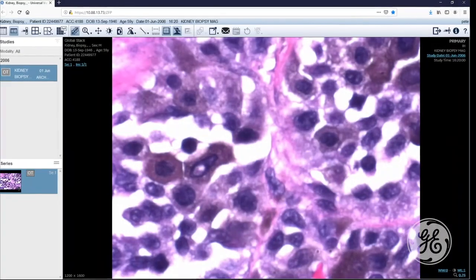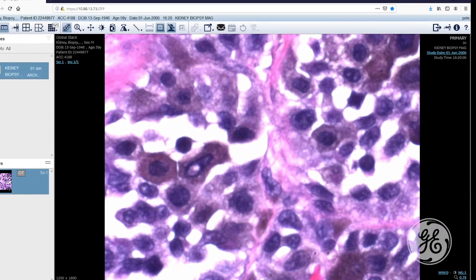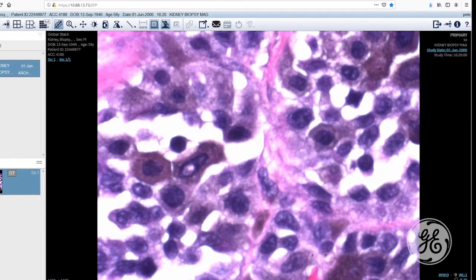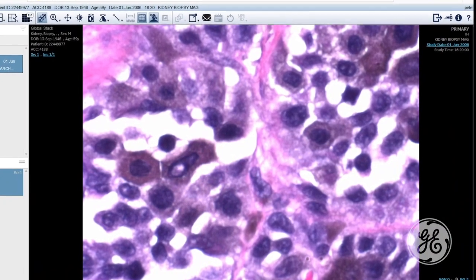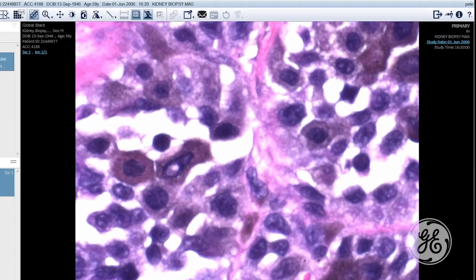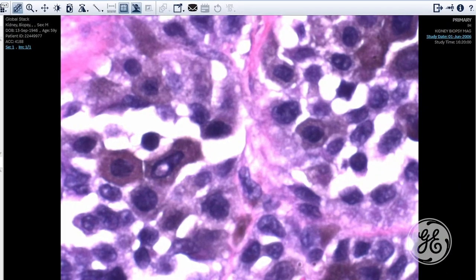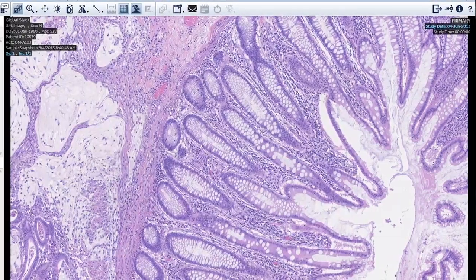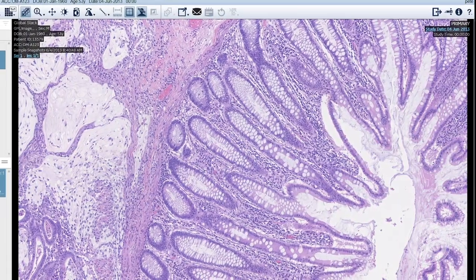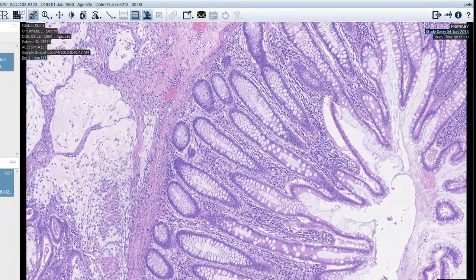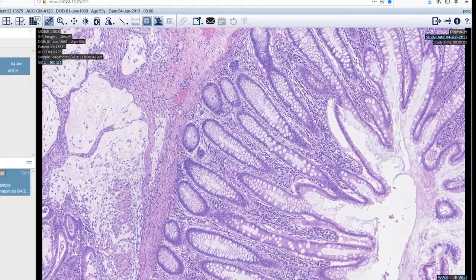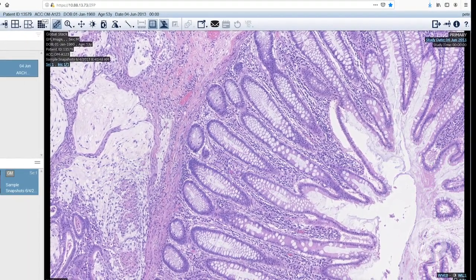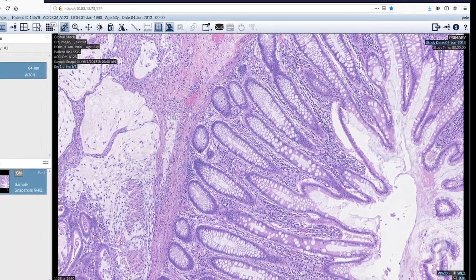The latest version of the GE Healthcare ZFP can display both DICOM and non-DICOM images. Rather than wrapping non-DICOM content such as optical images and ECGs to look like DICOM images, GE Healthcare uses international standards to display these non-DICOM images as they are.